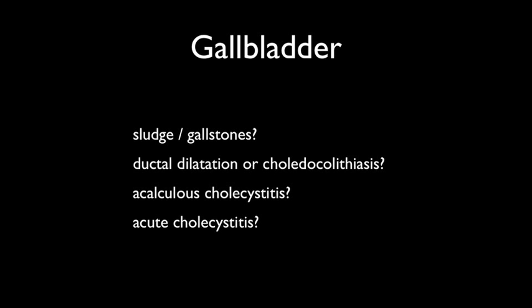The gallbladder is a pear-shaped bile-filled sac nestled in a concave fossa on the visceral surface of the liver. It is best visualized after a fast of 4 or more hours because of its distensibility. The gallbladder is examined in its long and short axis, with careful inspection for gallstones, luminal contents, wall thickness, and surrounding pathology. Another useful area to image is the biliary tree, and provides answers to the following questions.